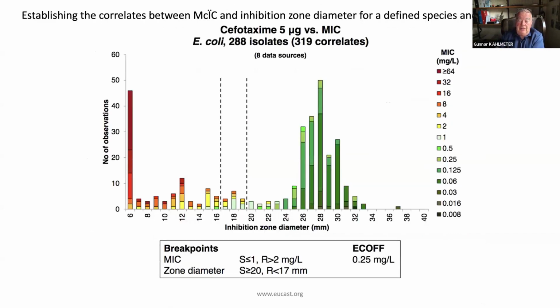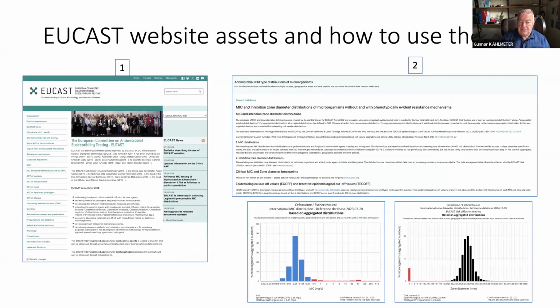This is what it looks like when you then take that to disk diffusion, and you can see the green bars are representing the wild type. The red bars are representing those that are resistant by the clinical breakpoint of R more than 2, so 4, 8, 16 and upwards. And then we always have an area of technical uncertainty in the middle where we're not quite sure because of the expected overlap between different MIC values once it goes to zone diameters.